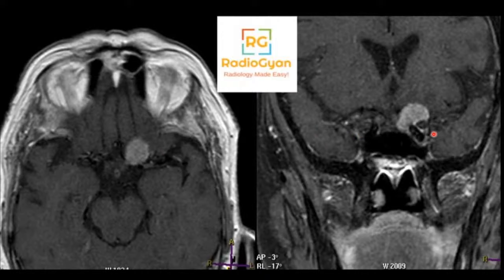A historical sign which we don't see, but if we do a perfusion imaging, say to distinguish it from a malignancy, rarely meningiomas can appear aggressive. And in those cases, we may need to do a perfusion, although it's not practiced now. But what is a historical sign that is commonly seen on angiography?